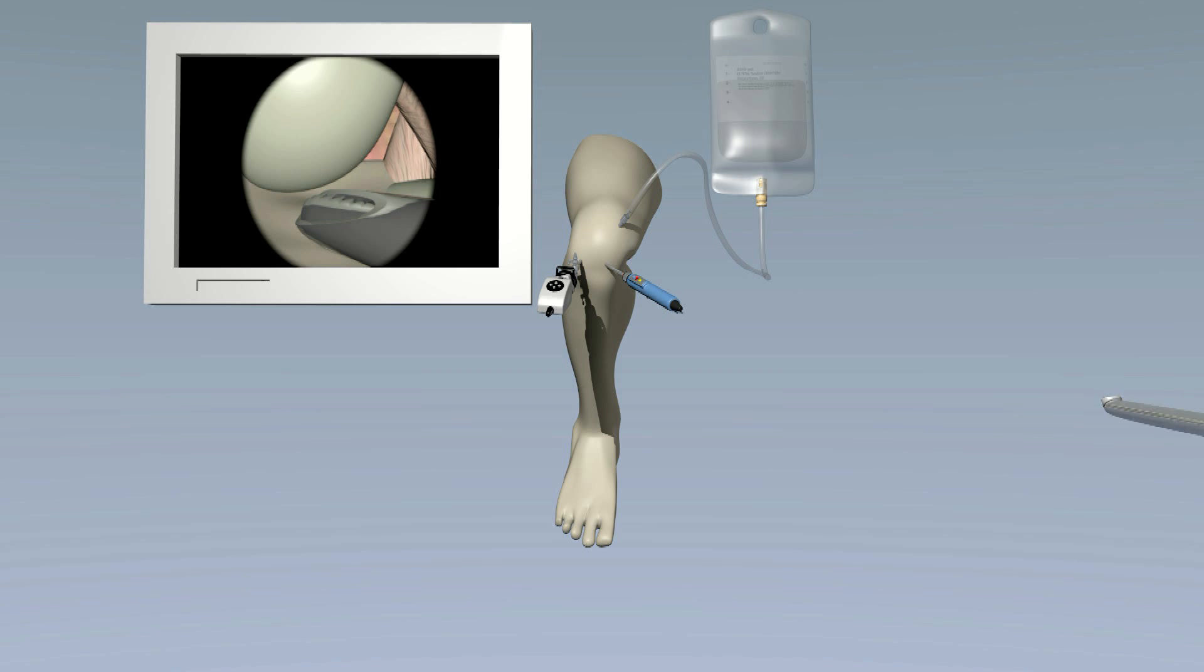A cautery probe can be used to remove adhesions and unwanted tissue. Knee arthroscopy is a minimally invasive procedure used to treat a wide variety of knee problems.